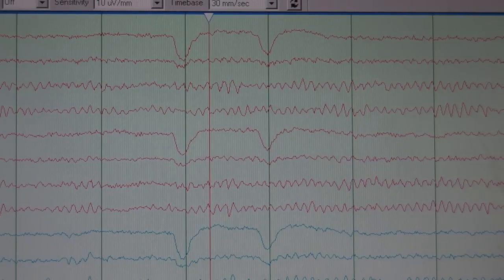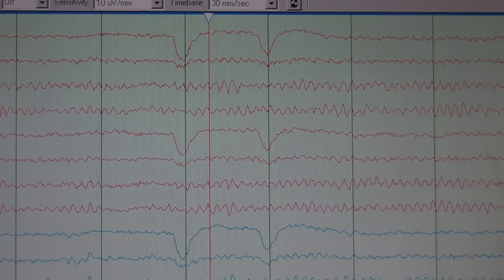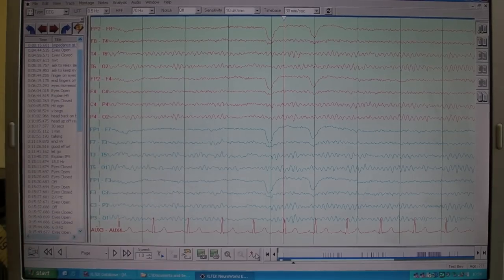These big dips are eye blinks. This channel here is just a basic ECG, so just showing a heart rate.